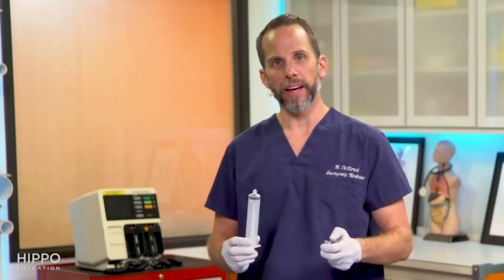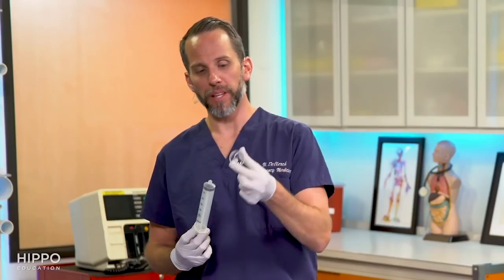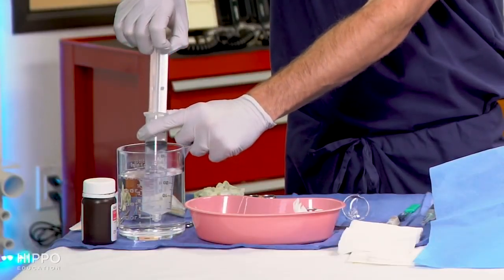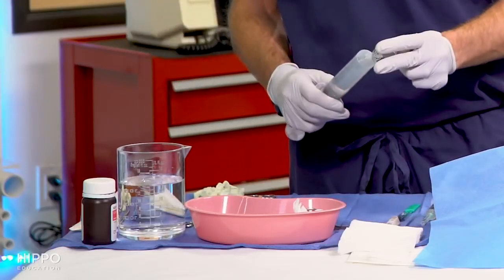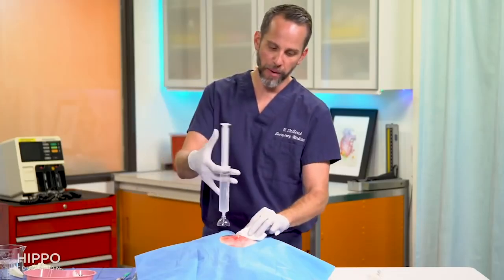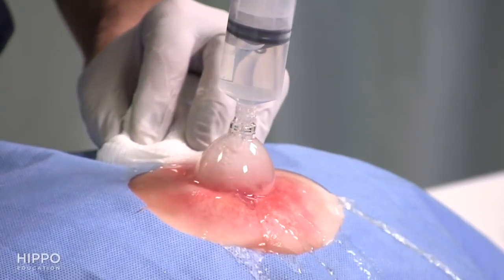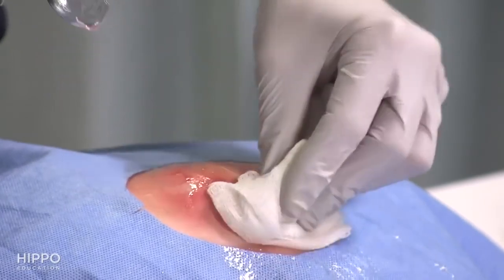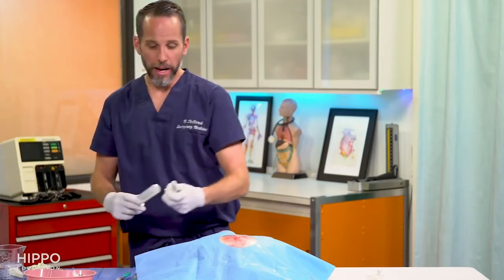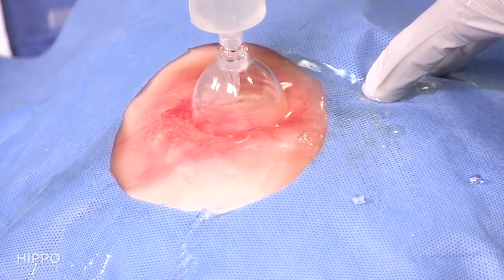After blunt dissection, you want to irrigate the abscess. Use a large syringe — I like a 60 cc, but 30 cc is fine. These often come with a protective splash-guard cap that pushes the saline in while protecting you from spray back. Normal saline works best; tap water can be used but normal saline avoids contamination concerns. Put the cap on, grab some extra 4x4s, and pressurize the cavity with saline. The irrigation helps debride necrotic tissue. It will be messy, so use towels to absorb the runoff. Continue until what's coming out is relatively clear and you've done adequate irrigation.